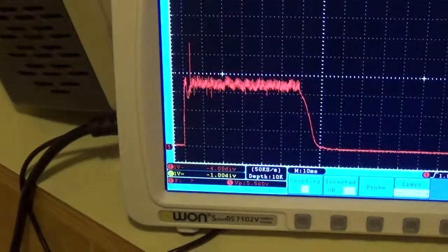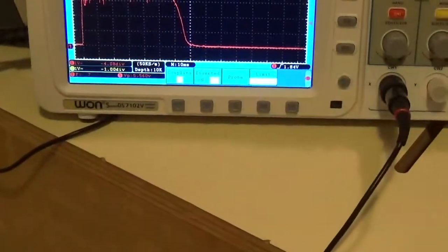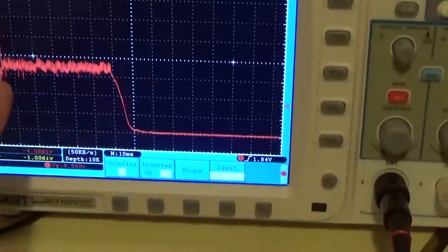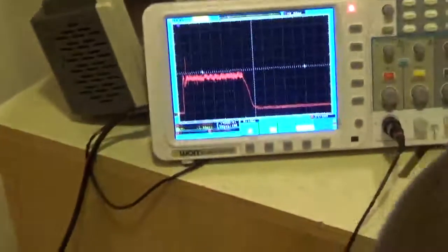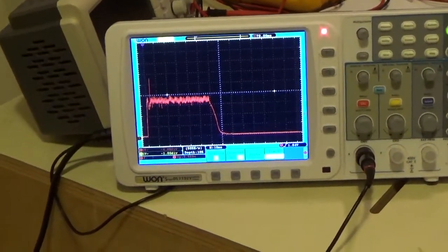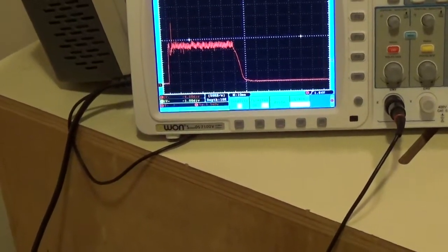All right. Didn't make a huge difference. Still got a little bit of undershoot there. So more? Well, here's the weird thing: we're going to go a little more, and if it doesn't get any better, we've got to go the opposite direction, because this might be the beginning of the pulse, and it might be trying to bring it down. Looking at MA stabilizers messes with you. So it goes up too high, too low, and it goes up too high. That's why it's better, the old ones, that you could turn that off. You can't shut it off on this generator. Could you jumper it out on the board? Nope. It's just part of the circuit.